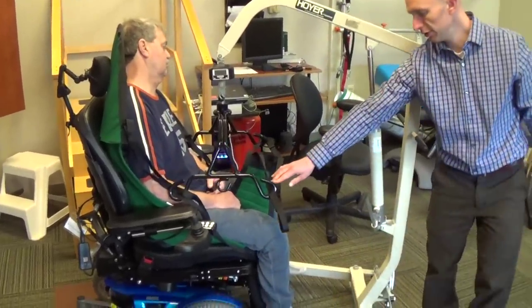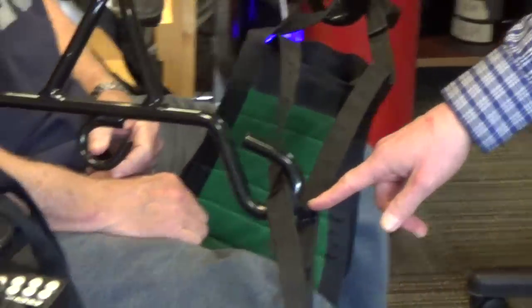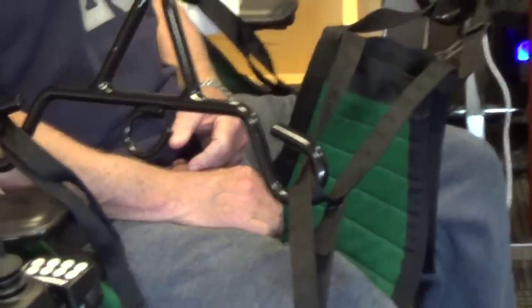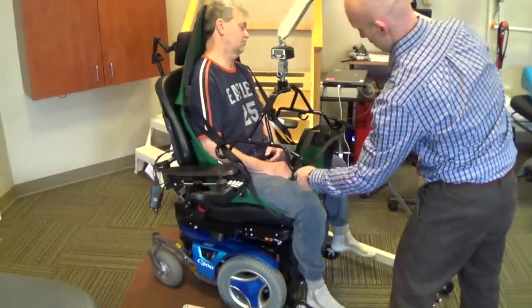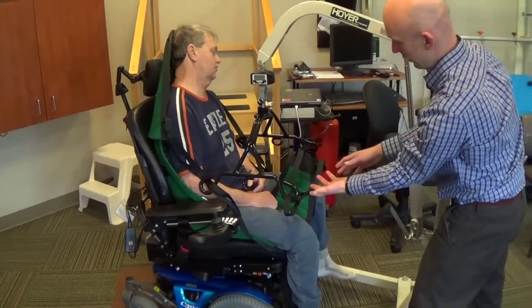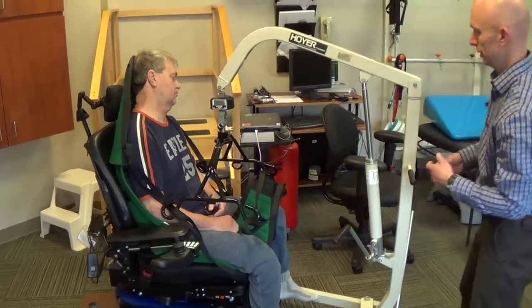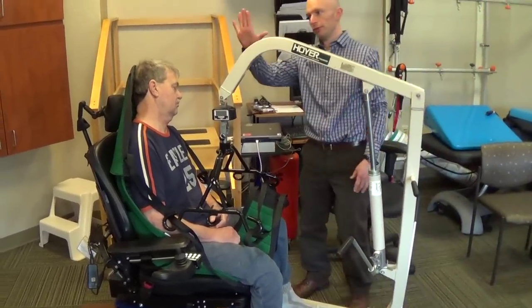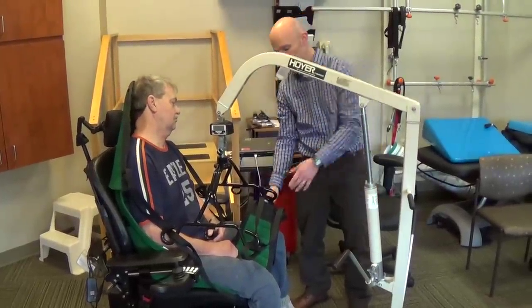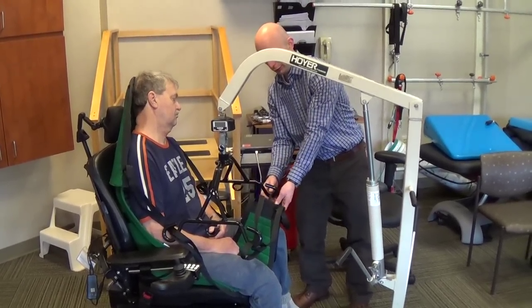If you can see here, this position, with the furthest loop, or the closest loop in, would have the person sitting in a more upright position. So we're going to lay back in bed, and they need to be flatter. We can go to the most outside loop. Or if someone's unable to tolerate being more at a 90 degree angle with their hips, you can also put it in the furthest loop out.